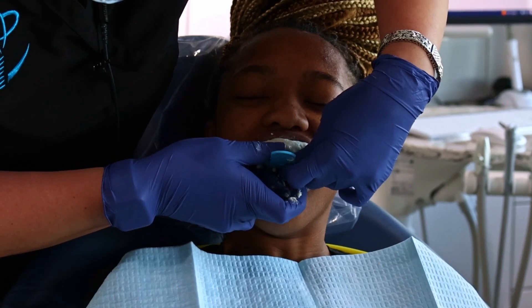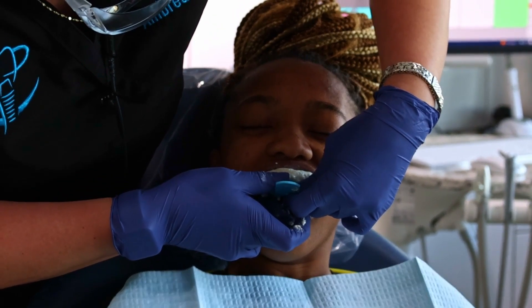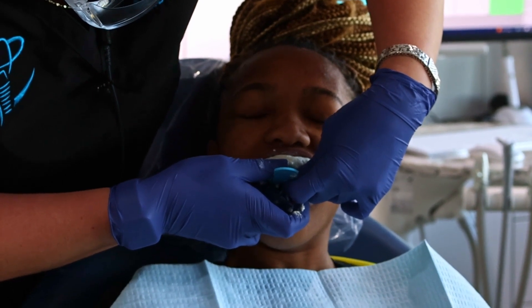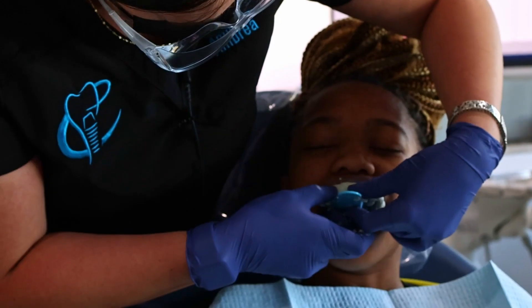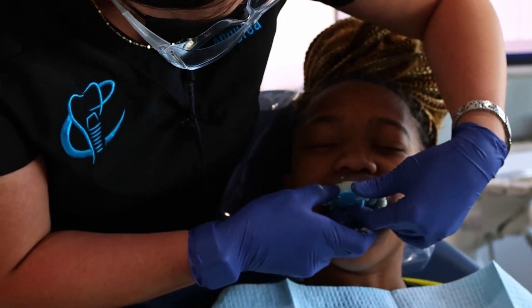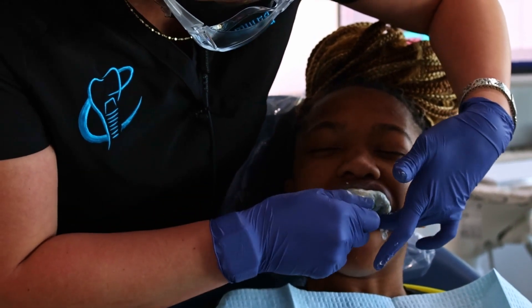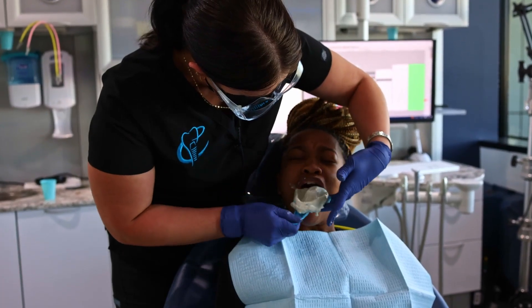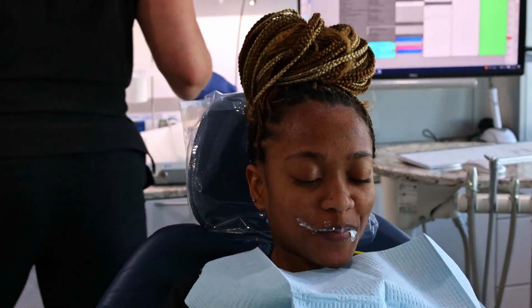Good. Take a nice deep breath. Switch to the other leg — pull one leg down and the other leg up. There we go. 30 to 40 more seconds here. I'm going to go ahead and take it out. It's going to be a big suction. And here we go. Great. Go ahead and close. I'm going to get you a tissue and some water.